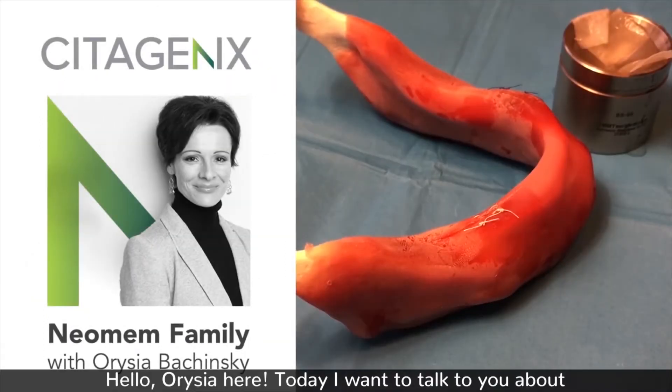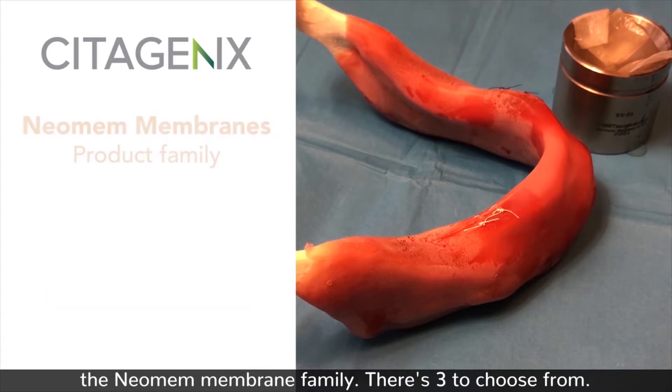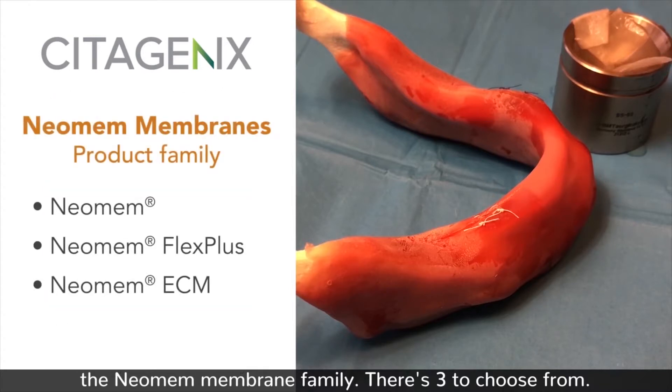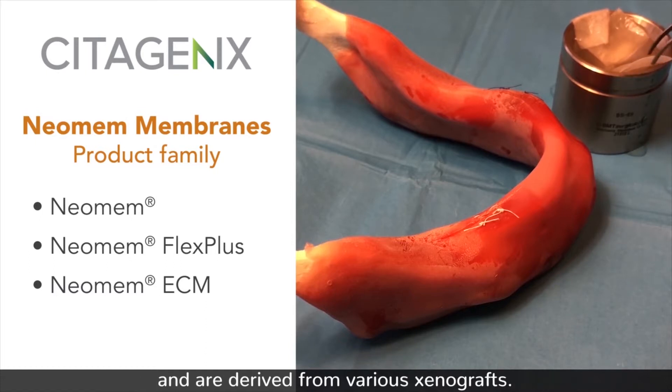Hello, Arisha here. Today I want to talk to you about the Neomem membrane family. There are three to choose from, and they all have slightly different handling characteristics and are derived from various xenografts.